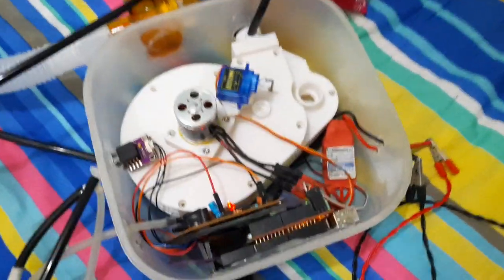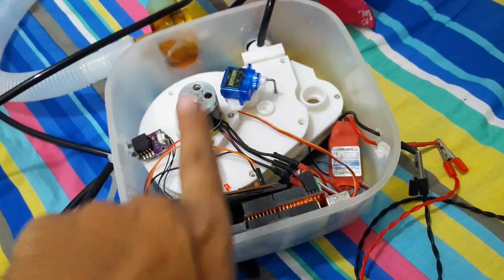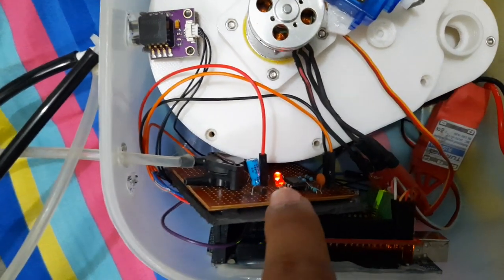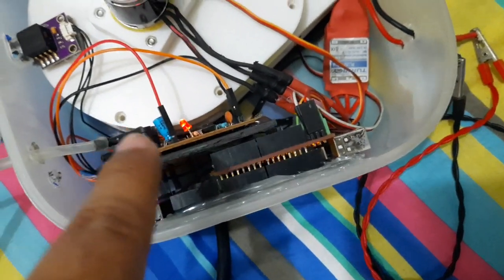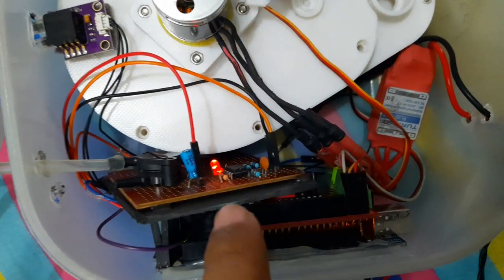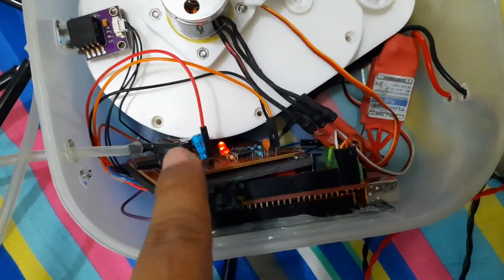So okay, this is the ESC, electronic speed controller, for controlling this BLDC motor. In another version we are not using this BLDC motor. We will use a more efficient but less expensive motor. Okay, so this is the control circuit. Here is the op amp for this differential pressure sensor, but I have planned to replace this differential pressure sensor because this output is very low and we need an op amp, and the whole system creates some error. But we have managed the error because the CMRR of this op amp is good for this sensor, so we can reduce the error.